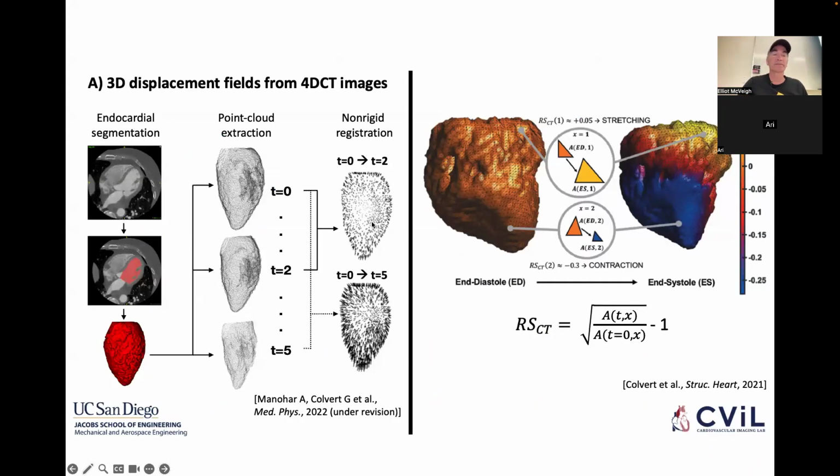The overview of that: we have a CT scan at some time at end diastole, say, and we segment out all of the blood in the left ventricle. This is now done with deep learning, right? The segmentation is done pretty fast. We recently segmented 500 patients, 20 time frames, in one weekend. That would have taken 4 years without the deep learning.